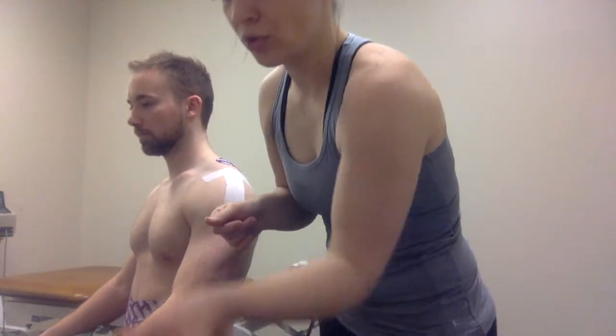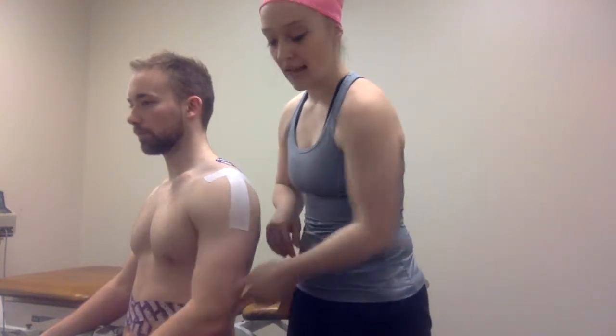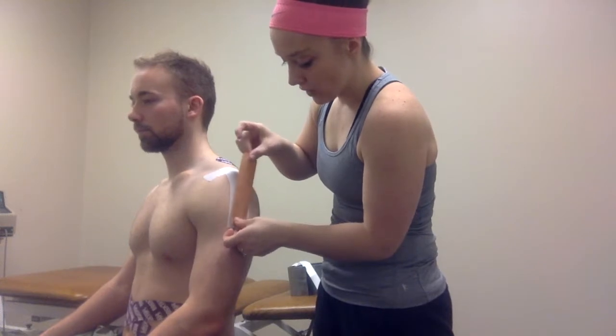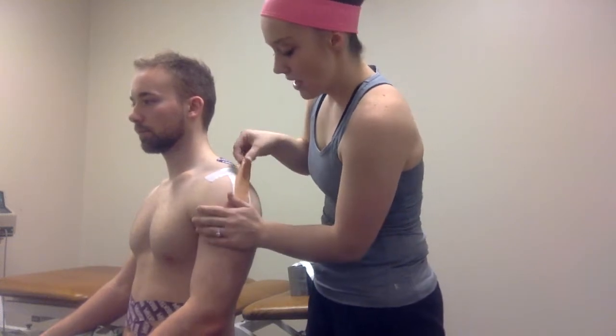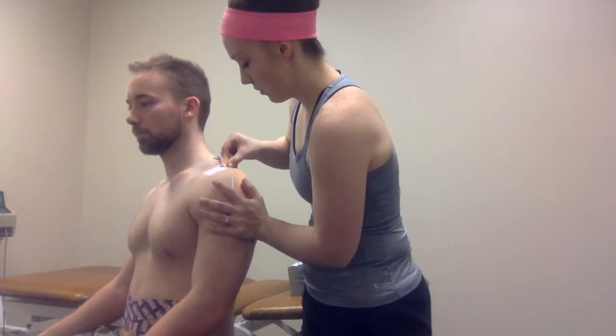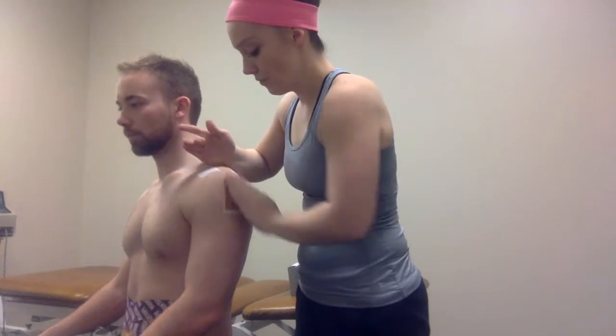Then you're going to take the Leukotape, which I have cut previously. You want it just shorter than the white tape you have laid — about a half centimeter on each side shorter. You want the patient completely relaxed. This one you'll also start at the insertion of the deltoid, and then pull up with tension and lay that down. You want to see that skin pucker.